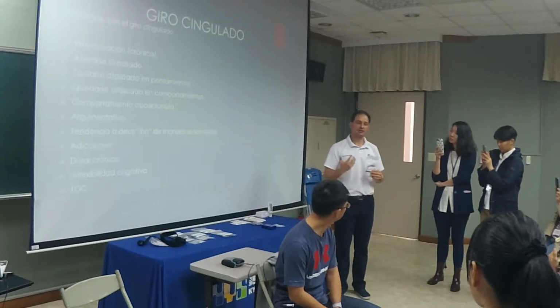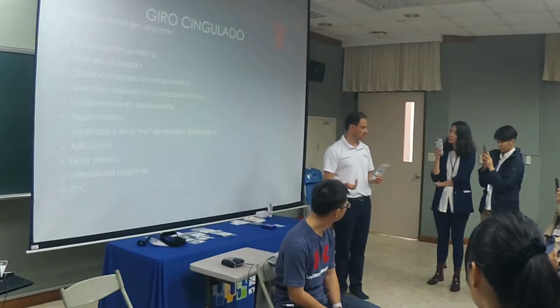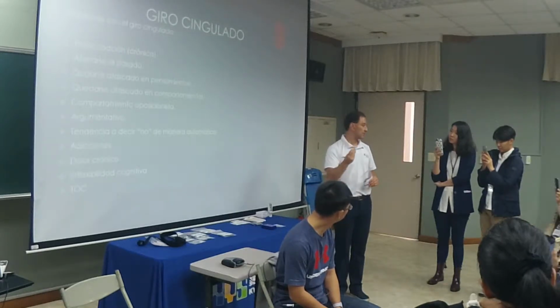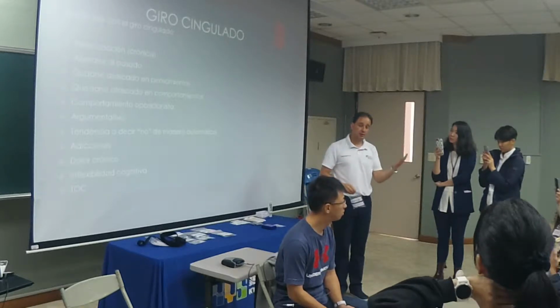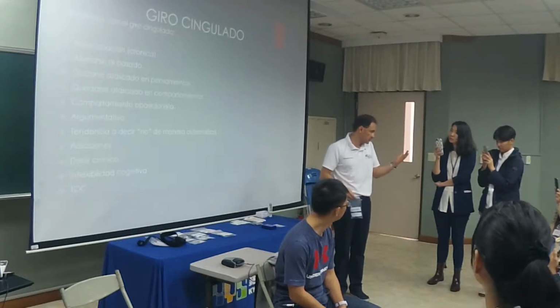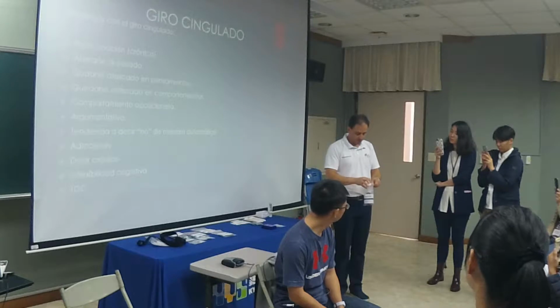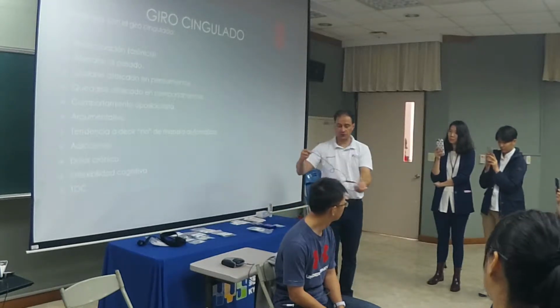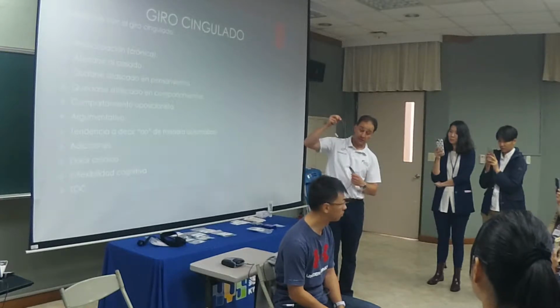My thinking is test where you feel best. Sometimes I use the dominant hand, whether it's the right or the left, because that's where you get a better signal. A lot of people like the non-dominant hand because that's where you get a better signal. But for practical purposes, we're going to go with the right. Are you right-handed or left-handed?